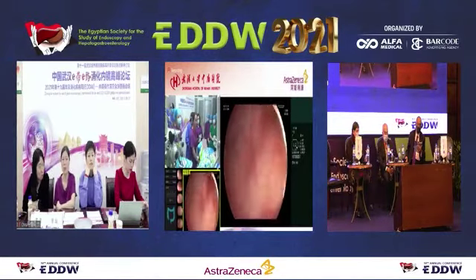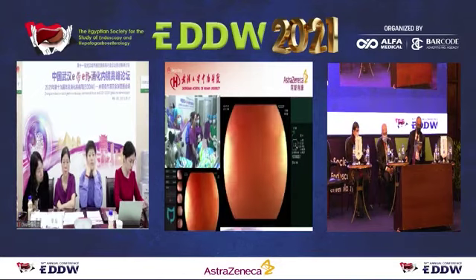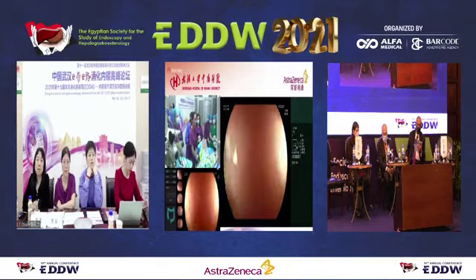Dr. Liu, do you think AI colonoscopy will help to characterize diminutive colon polyps?